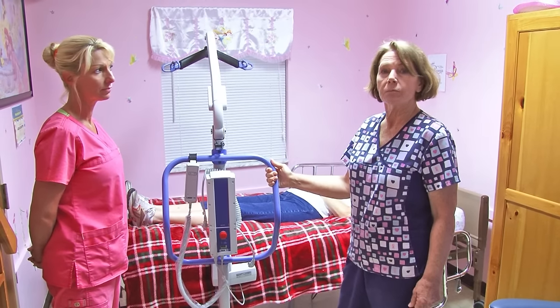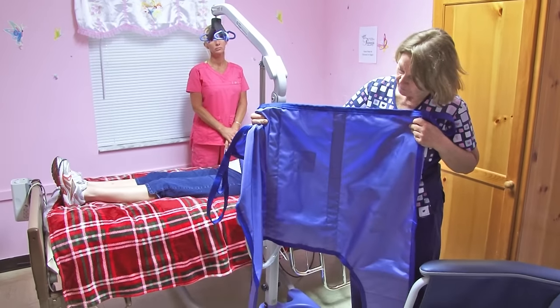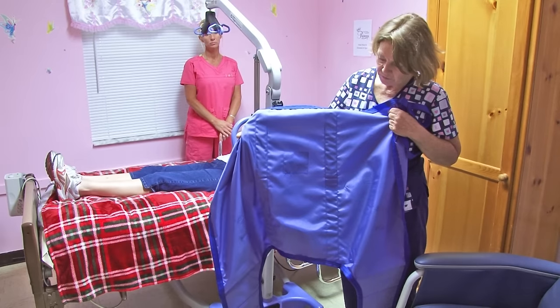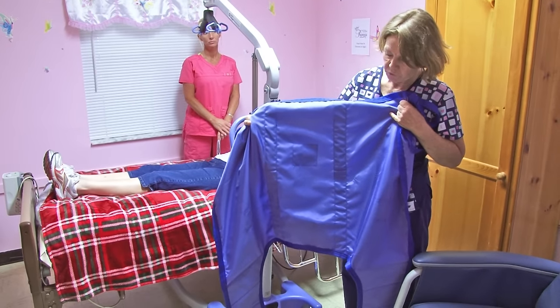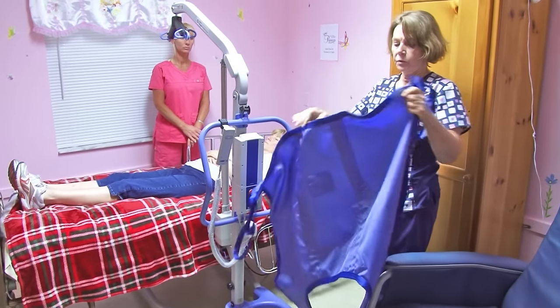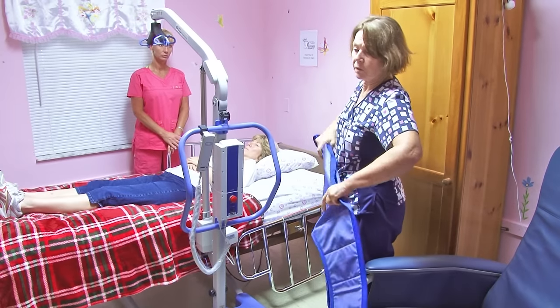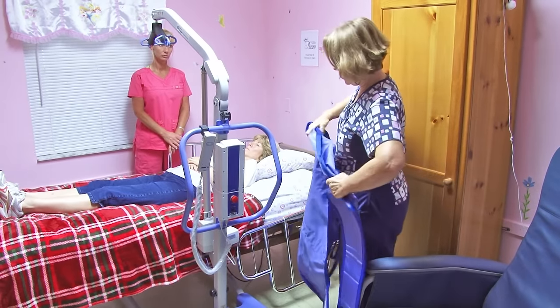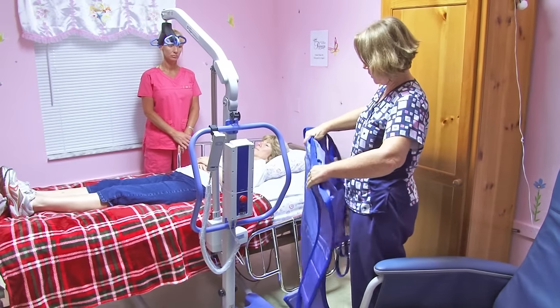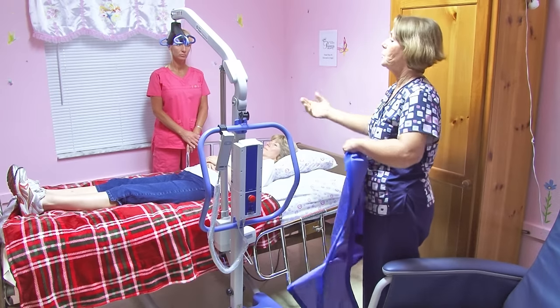This is the sling. This is the inside that will be against the resident, because it doesn't have any loops — so the smooth side goes to the resident. This is the top, which goes to the shoulder. We will be rolling the resident towards the window, towards Beth, and I'll be placing this underneath the resident, and then we'll roll the other way.